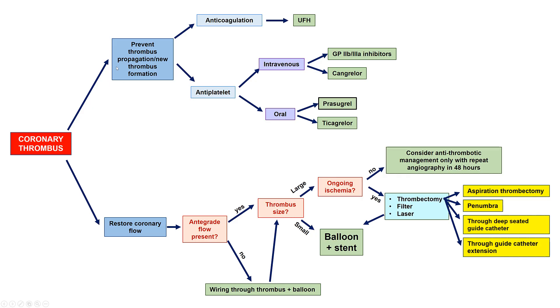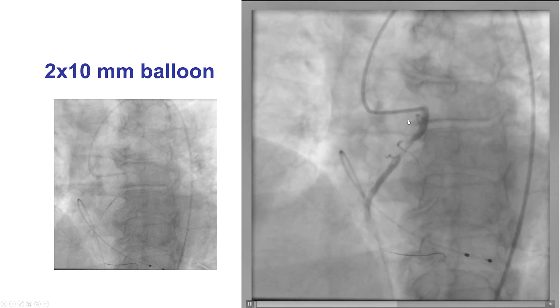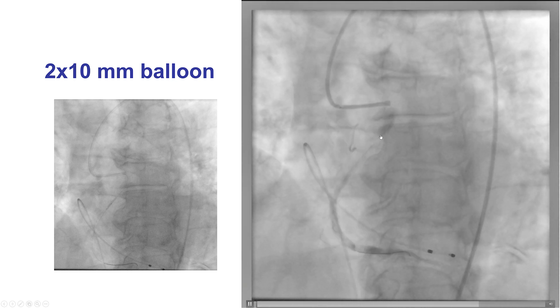The next management is standard for thrombotic lesions: aggressive antithrombotic and antiplatelet therapy. Here the patient received heparin as well as ticagrelor. Then restoring coronary flow — first wiring and ballooning with a small balloon, and then determining if there's a large thrombus that would require thrombectomy before performing stenting. After a small 2.0 balloon was used, there was restoration of antegrade flow into the right coronary artery.